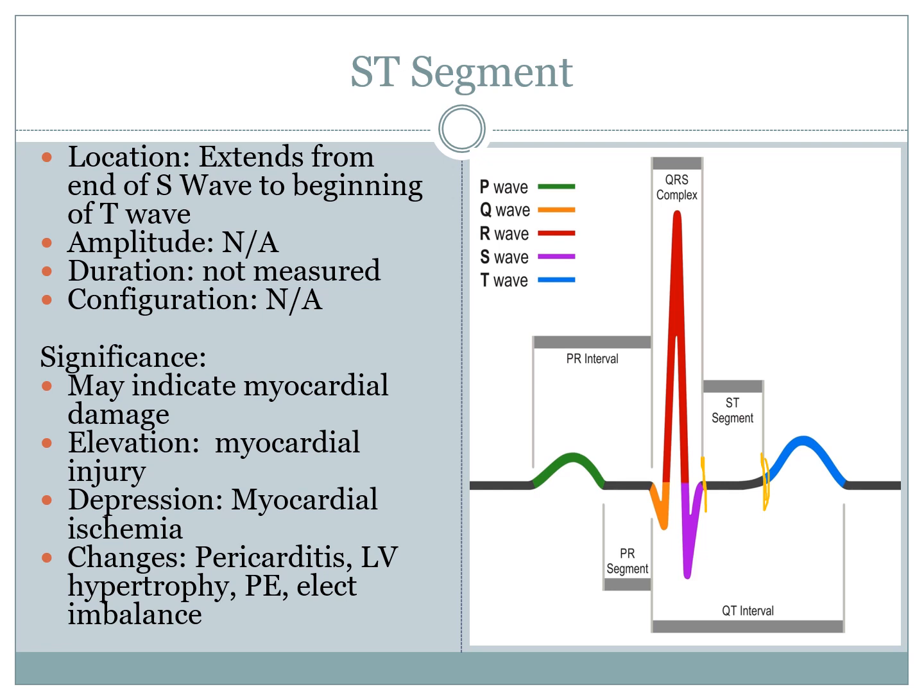Now, we're not really interested in how long it is or how much amplitude it has. The main thing we look at when dealing with the ST segment is whether it's above or below what's known as the isoelectric line. So the isoelectric line essentially means if you look at the line before the P wave and the line after the T wave, then the ST segment should be at the same millivolts as those lines. Now, if it's different, then that essentially denotes some form of myocardial damage.